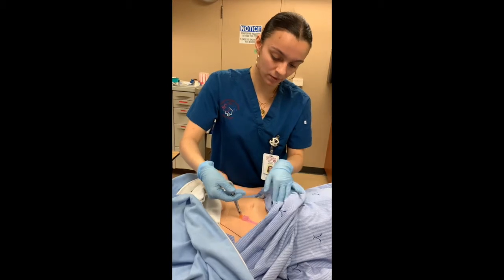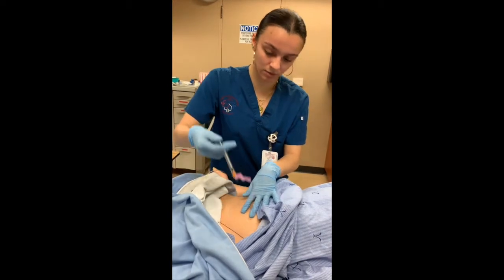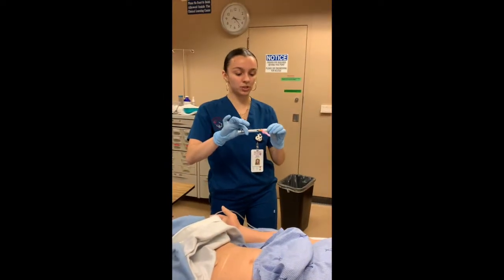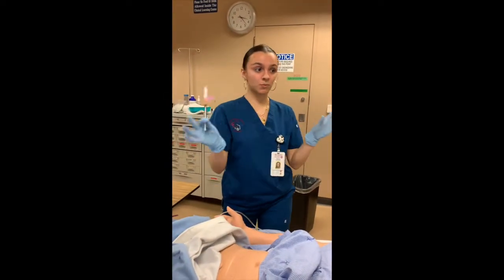There we go. Once that's done, you want to take it out. And once you do this, you always want to put the cap back on, and then you always want to discard them in the sharps bin. So that's what we would be doing.